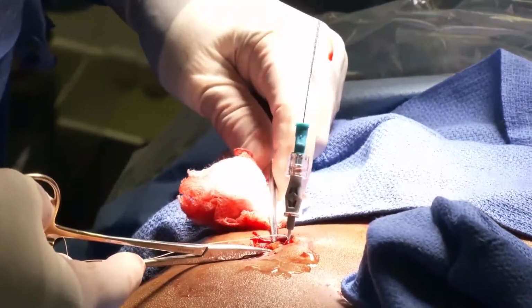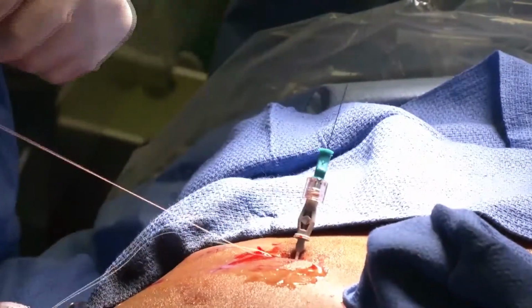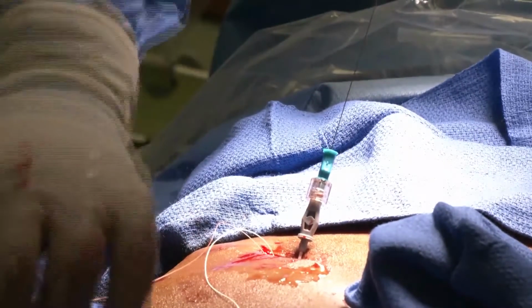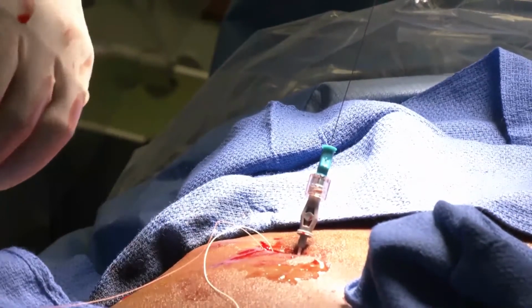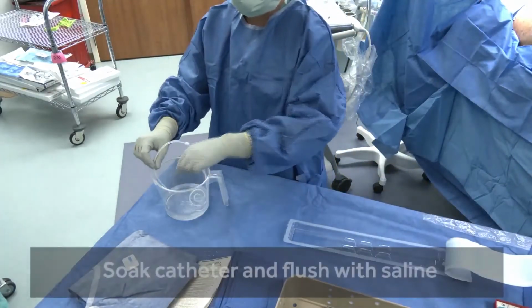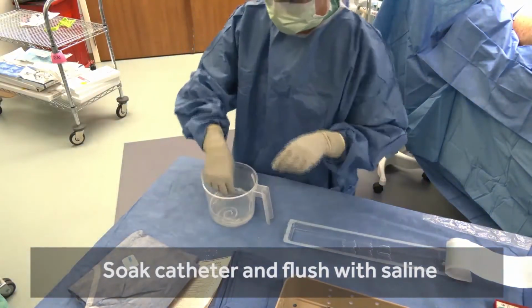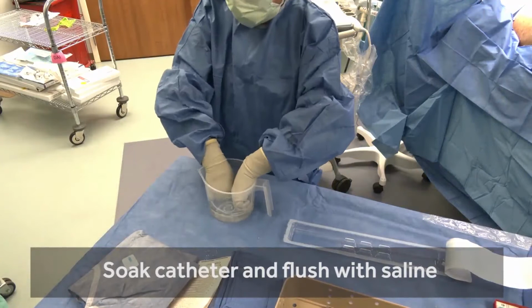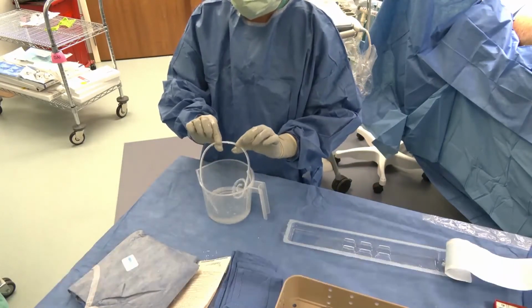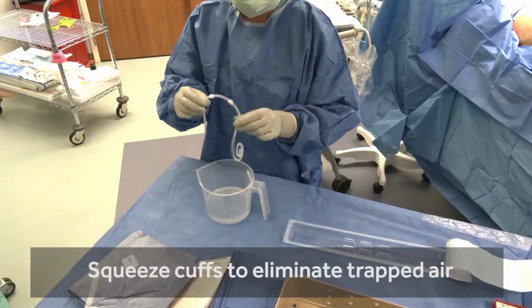Now I'm going to place a single 2-0 absorbable stitch into the fascia, and that's going to be used to secure the distal cuff. And here on the back table, you can see the catheter being prepared. The scrub nurse will lubricate the catheter by immersing it in saline and also rolling the cuffs to expel any air that may be trapped within the material.